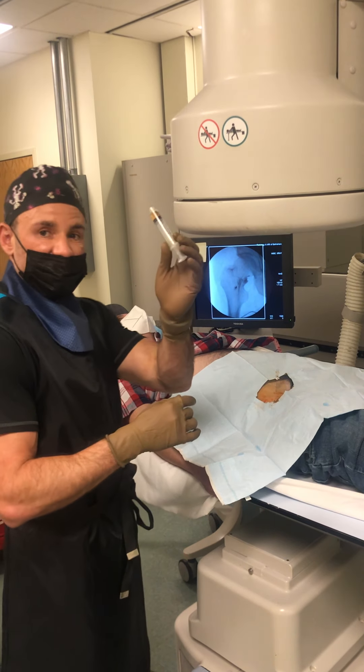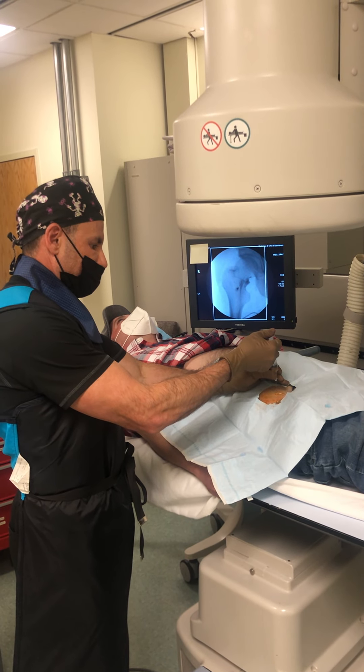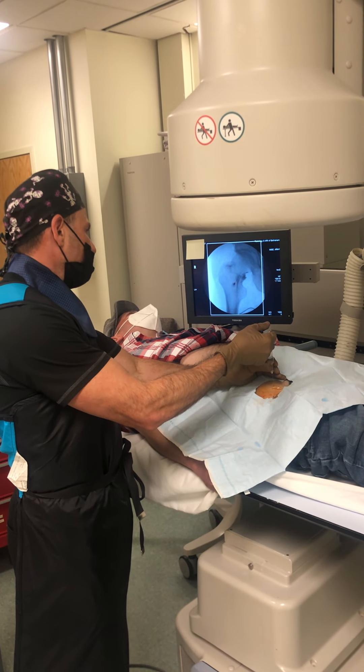And then inject the second half of the PRP right along the femoral head. You're going to feel a ton of pressure now.